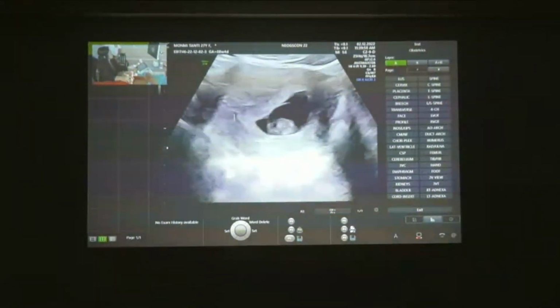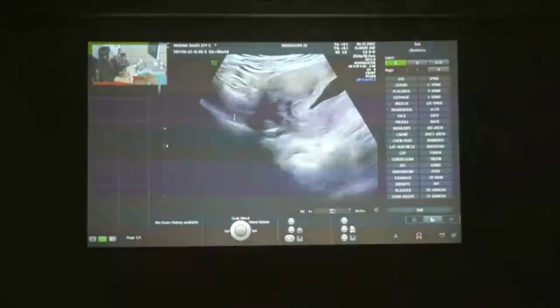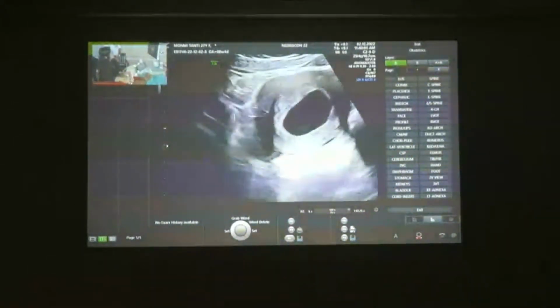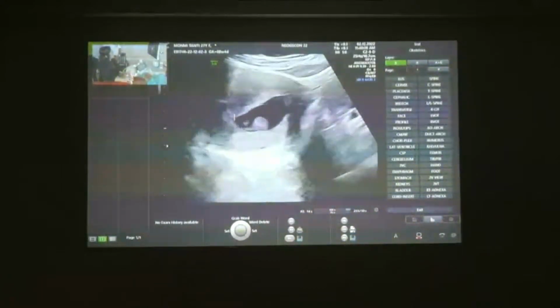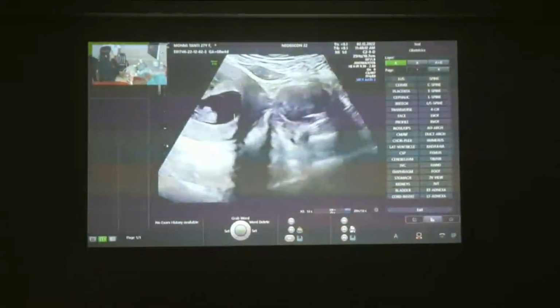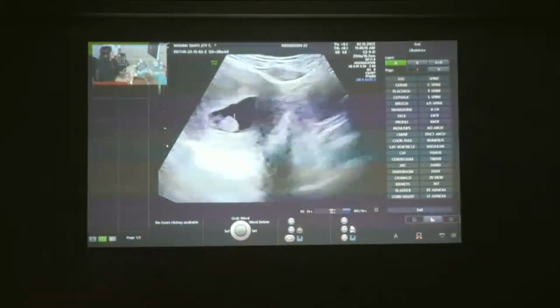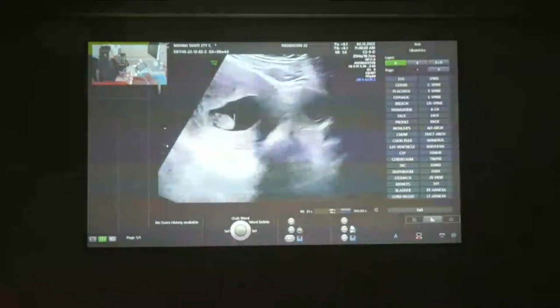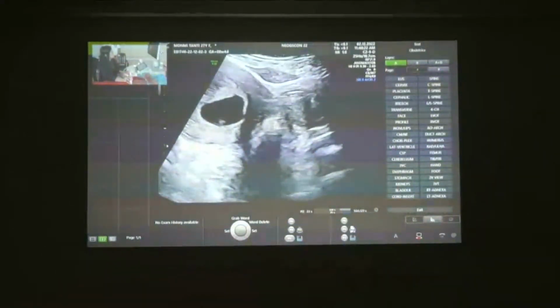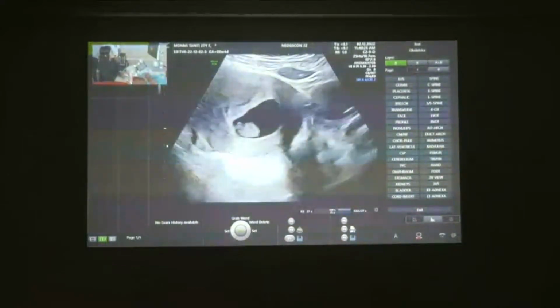Then at this stage, also always look at the fetal environment. Look at the two adnexa and the ovaries to rule out heterotopic pregnancies, because in around one in 30,000 to 50,000 pregnancies, especially if a patient has done IVF or assisted reproduction, sometimes we might find another pregnancy in the adnexa, so it is very important to rule that out.